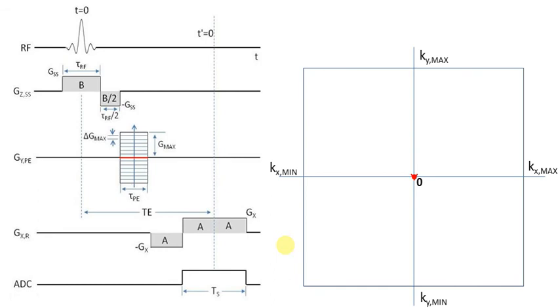Notice that for this one we have no phase encode gradient at this step, so we don't move. Now I've just skipped over and am showing you a bunch of steps at once, just to make this a little bit shorter for you. And then finally, this is our last step.